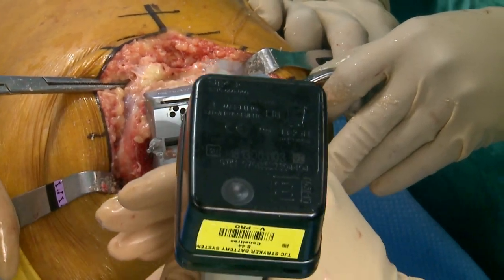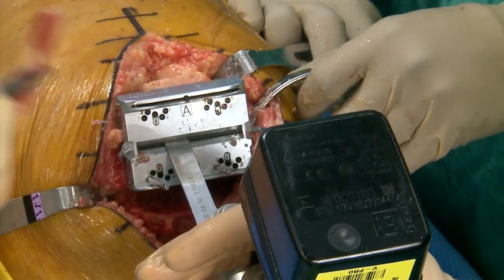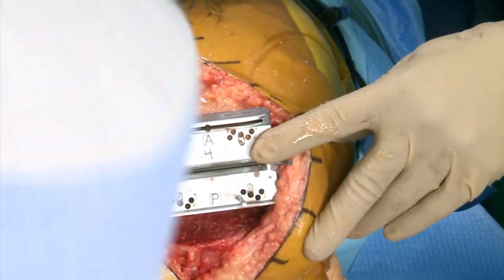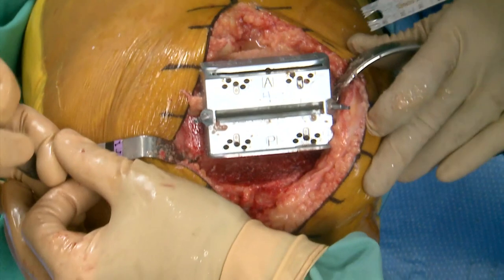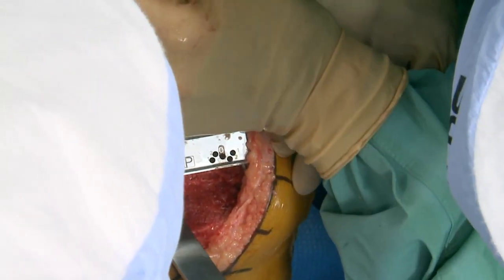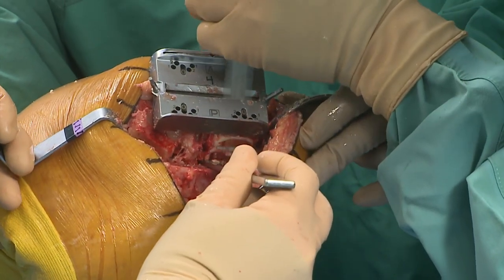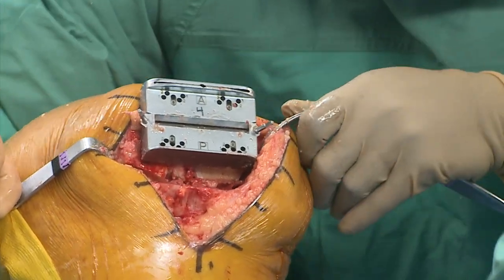We didn't have to put a bone plug in because we didn't instrument the canal, but we saved the bone from the cut. The assistants tell me that's their favorite part of the case, so I'm apparently providing job satisfaction by instrumenting the canal. Before we cut the notch I go ahead and clean up behind and take the osteophyte.